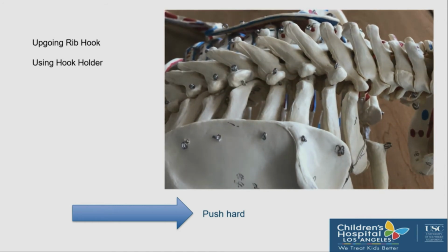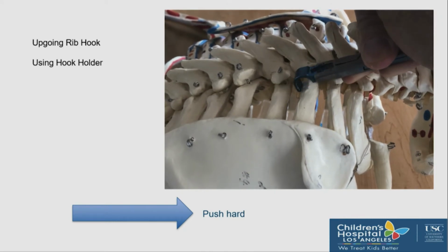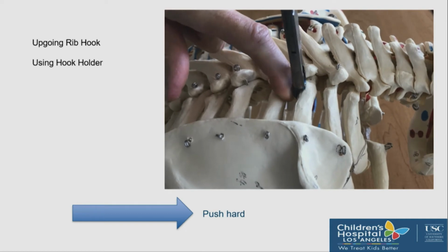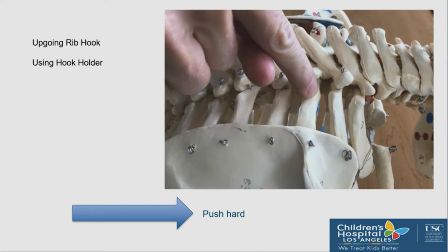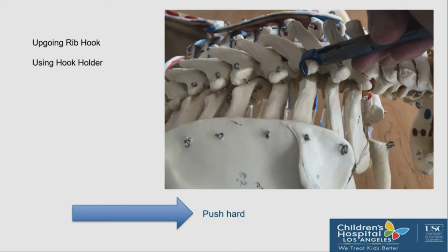You just stick your finger there. You push through the muscle. You feel the spine. Push the hook there and rotate it right in. So this is an example using a rib hook with a hook holder. I'm going to play this one more time. And I hardly ever use a bovie at this stage.